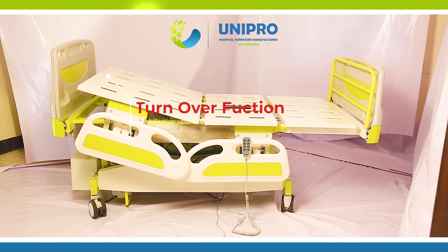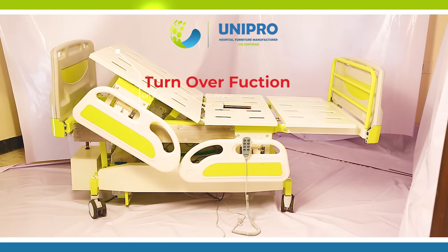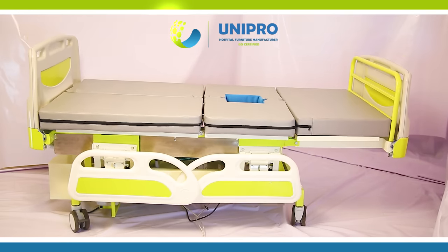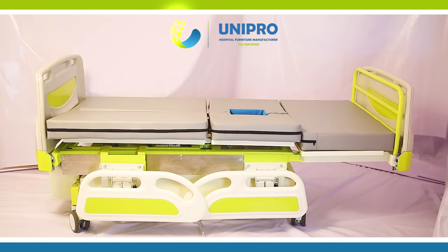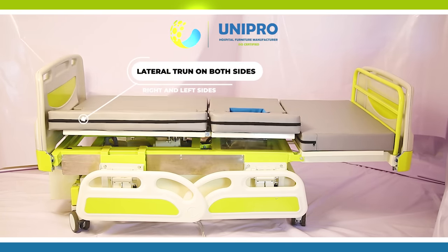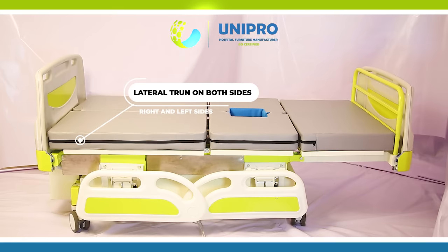Turn Over Function on Back Section up to 85 degrees. Total Court High and Low can be done. Lateral Turn on Both Sides, Right and Left.